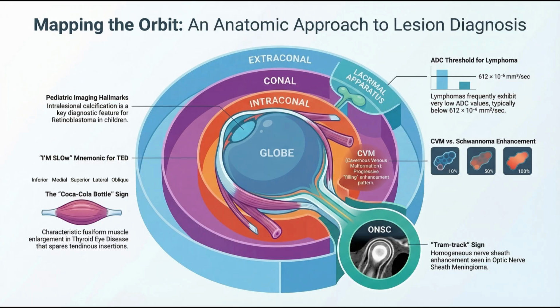The source has a really interesting take on this. They read the bone. That is the most reliable method. The adjacent bone tells the history of the tumor's growth over time. So starting with the benign ones.